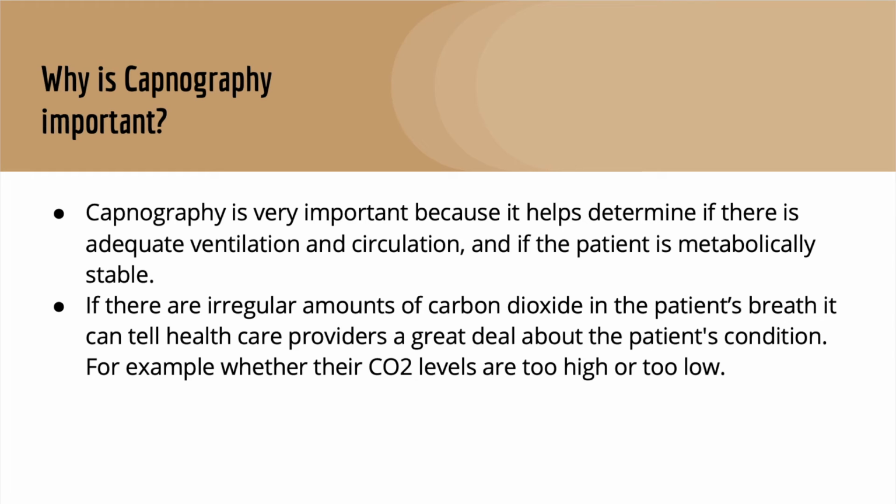So if there's irregular amounts of carbon dioxide in the patient's breath, it can tell the healthcare provider a great deal about the patient's condition. So for example, whether their CO2 levels are too high or too low.